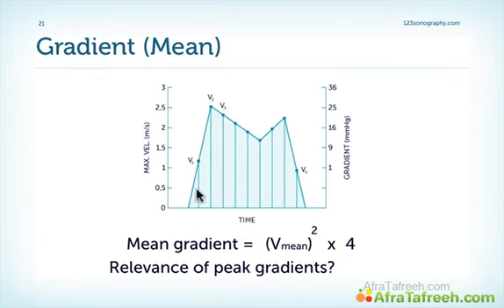So what is actually better is we can use the integral of the velocity, in other words the mean velocity, and apply that within the formula of Bernoulli to obtain a so-called mean gradient. Away from theory, let's turn to practice. Here's a patient with typical mitral stenosis and a beautiful signal. And here I'll show you how to quantify the mean and the maximal gradients.